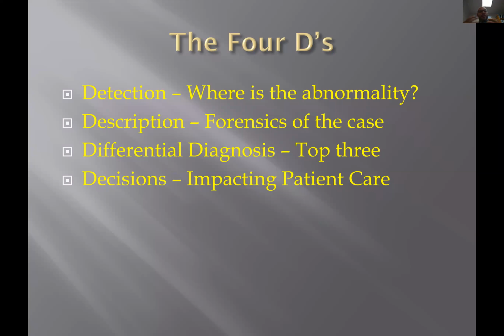Maybe just describing it, instead of asking you what the differential diagnosis is: how would you describe this? If you wrote a report, what kinds of words would describe the finding that you're seeing? So we'll practice that, and then obviously most importantly, what does it matter that we even took the picture at all? How does it impact our patient care?